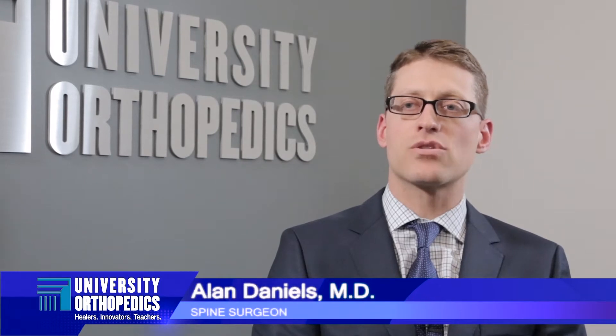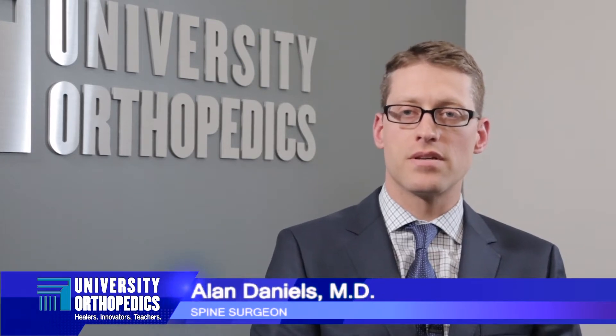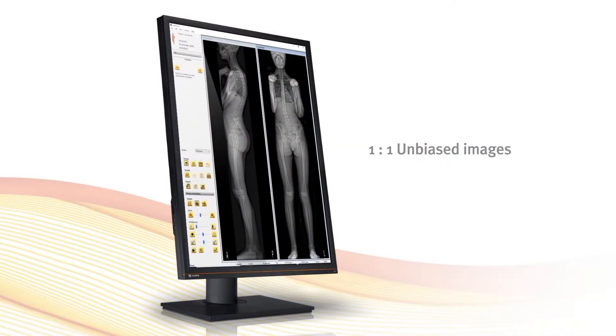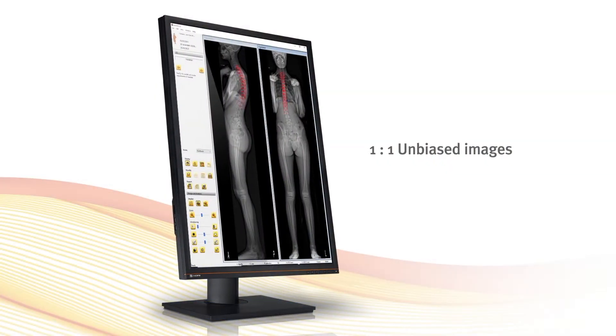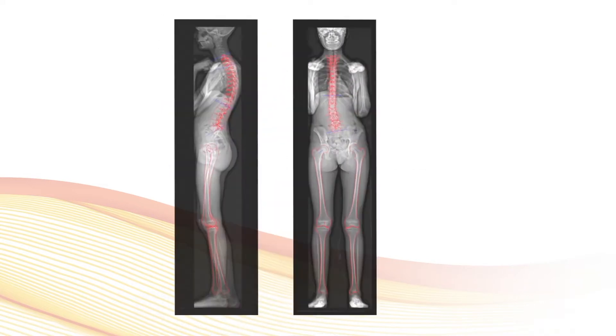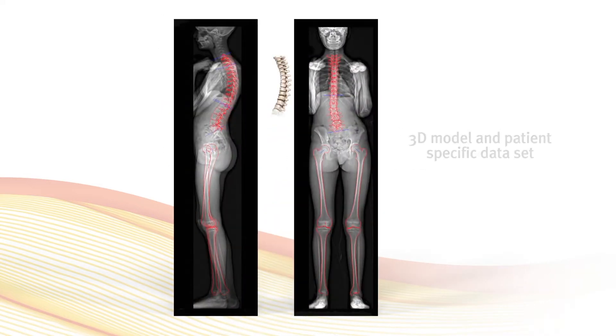EOS is a very powerful tool in that it provides the best quality X-rays that we can get, and it's able to do so with the lowest possible radiation, so it's very safe for patients. In doing so, you can create 3D models of the spine to better understand the patient's spinal alignment and plan surgery.